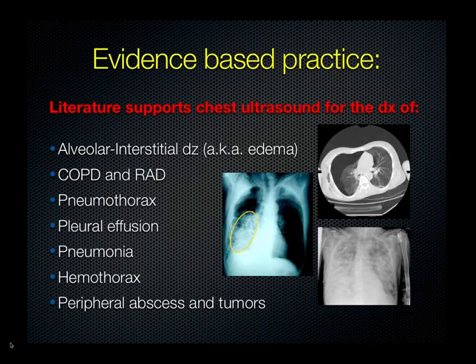So looking at the evidence, there is a great deal of evidence supporting the use of chest ultrasound for the diagnosis of many conditions, including pneumothorax, pneumonia, and ARDS.